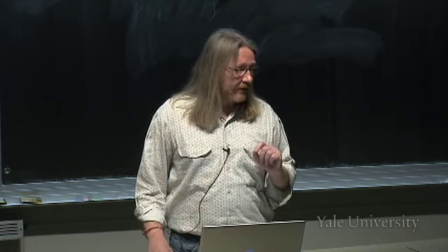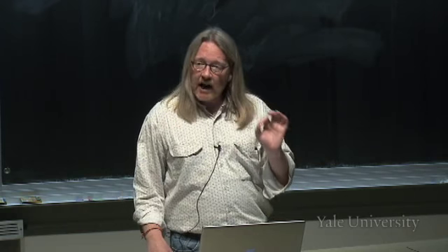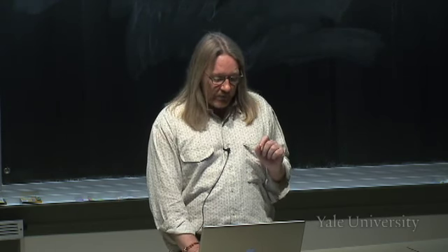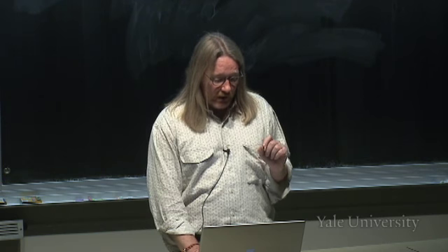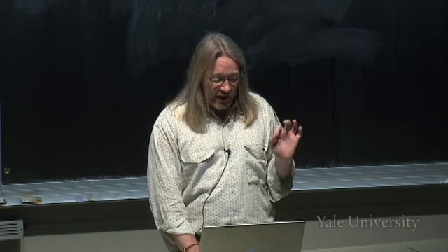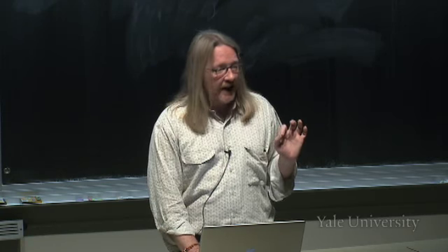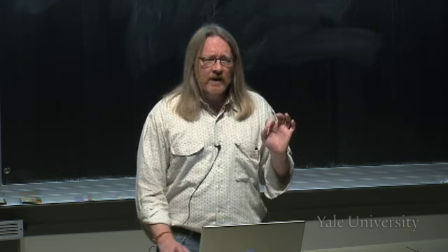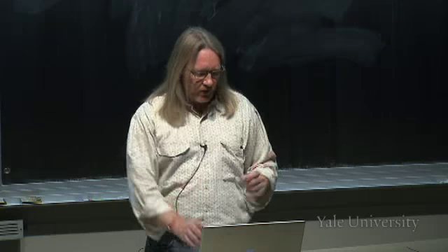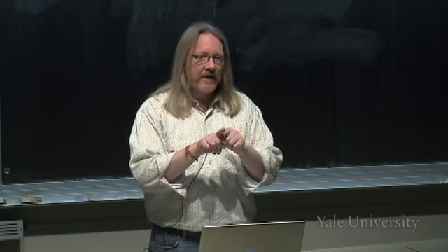Here, the chemical that's emitted is a special radioisotope that emits not gamma rays, but another particle called a positron. When positrons are emitted, they will move through tissue until they hit an electron. But positrons don't have to move very far. There's lots of electrons around in tissues. And when a positron hits an electron, they annihilate one another, and they generate two gamma rays, which move in opposite directions.